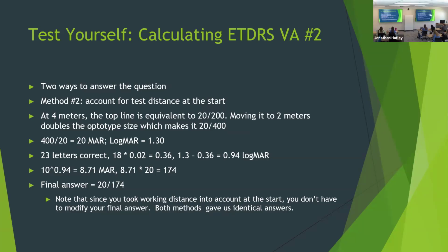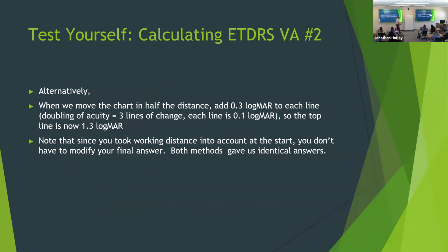But the thing is that I've had students tell me that there are some of these equations, and at least if you get comfortable with logMAR, if you see it on boards or if you see it while you're doing all the research papers and everything, then you're a little bit more comfortable. You understand what it means. So it's good to kind of have this knowledge. In practicality or in clinic, it's probably not used very much, at least not here. This is just something else. I'll let you kind of read through this, but basically the same. Talking about the same thing, rectifying the shorter test distance at the beginning of the equation instead of at the end.